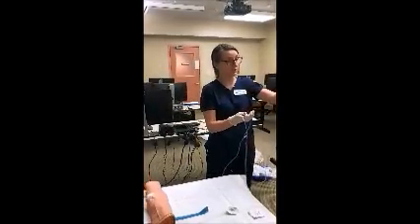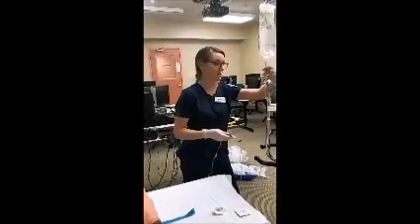Turn the watch around so I can see what I'm doing.